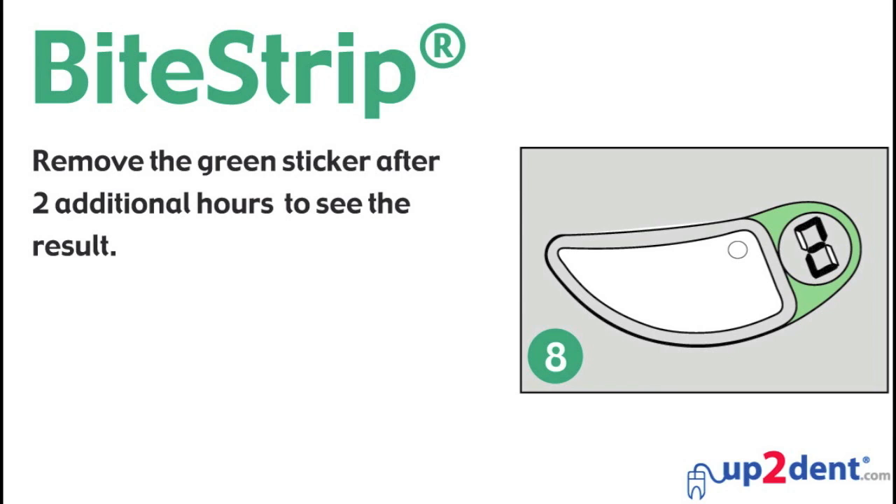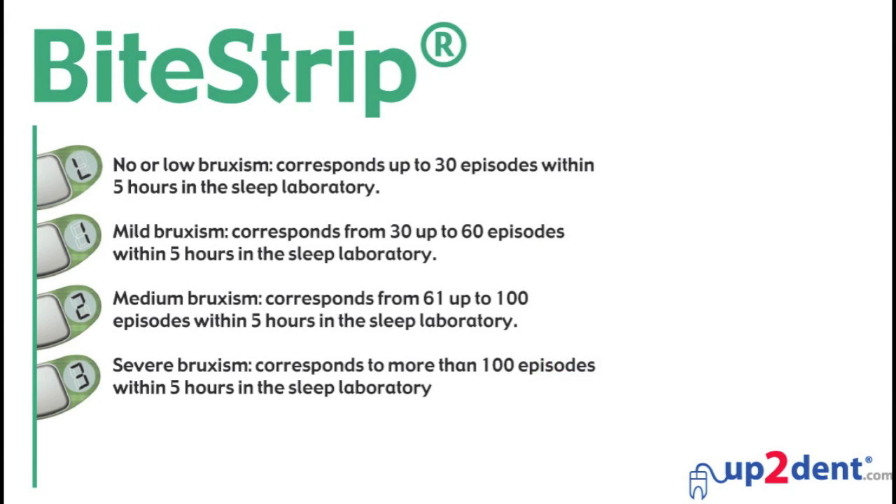Wait for 2 hours before you remove the green sticker. The results are shown on the display: L — no bruxism. 1 — mild bruxism. 2 — medium bruxism. 3 — severe bruxism.